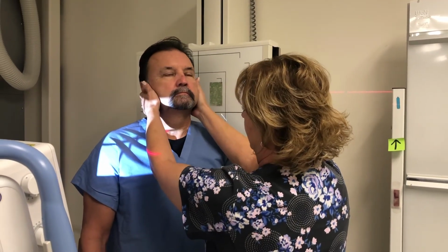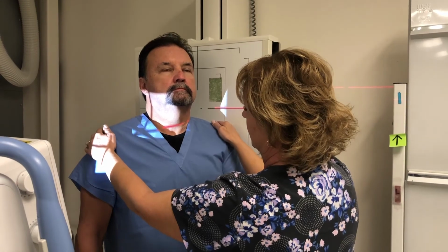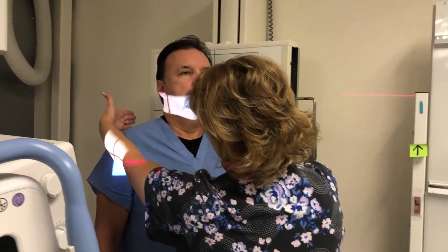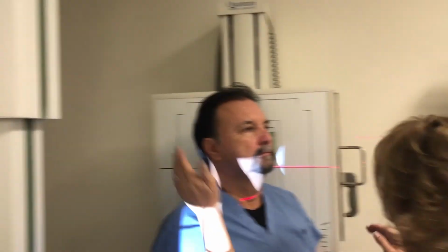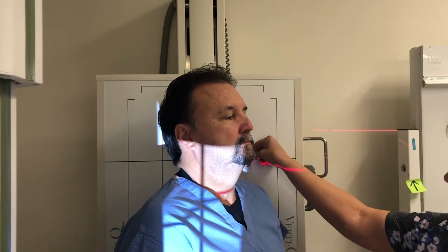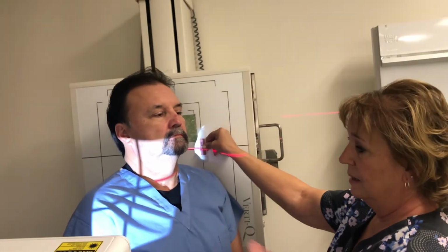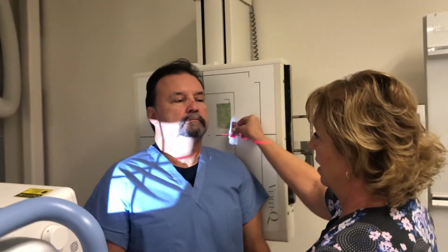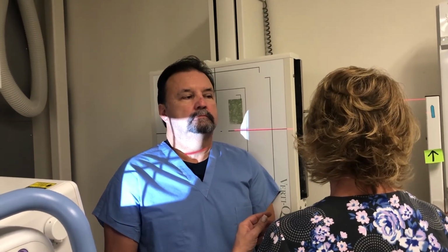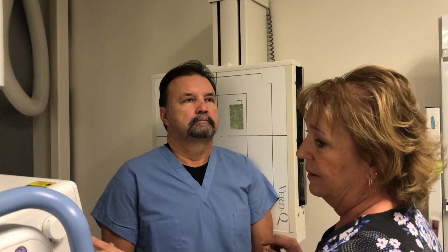So his mid-sagittal plane is lined up. He's rolled 45 degrees. I've got light in front, light in back. I've got my right marker. You could either put your right marker on that side or your left marker on this side. Since he's in an LPO position, I could do that. Really doesn't matter. That's up to the clinical site.